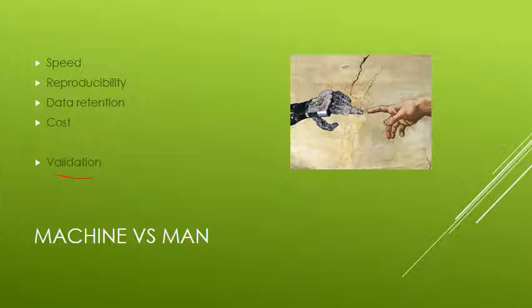You're not allowed to just say, hey, I got a new machine, I'm going to plug it in and start using it. And in order to do that, remember all that crazy math that we had to do. You have to figure out the accuracy, the precision, the analytic sensitivity, the specificity, the reportable range, all of those things, and also a reference range.